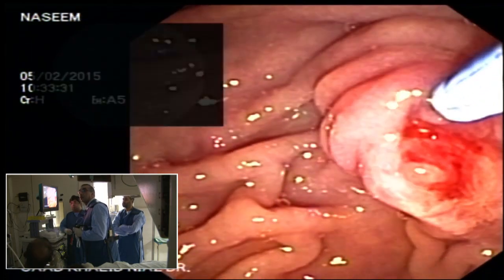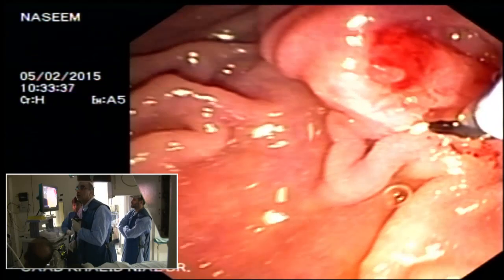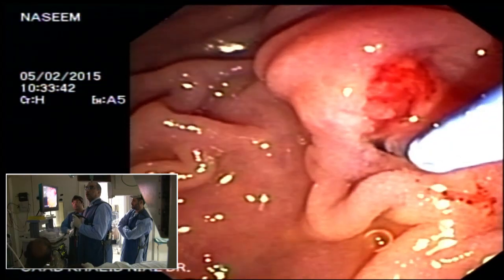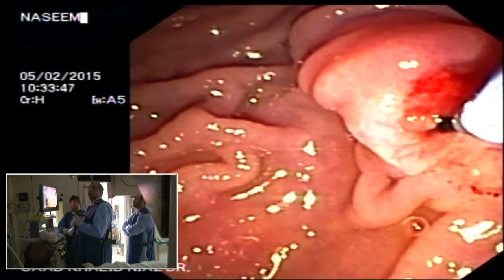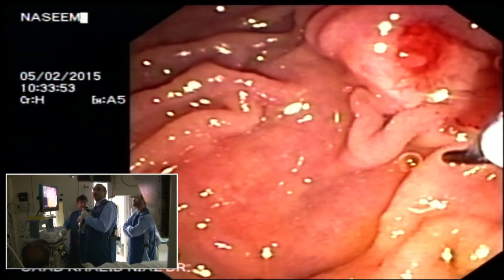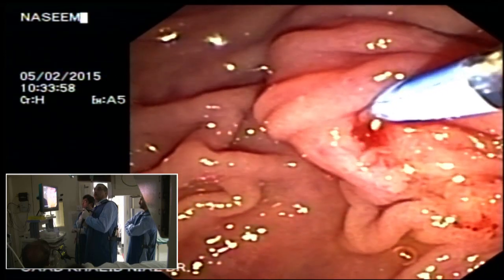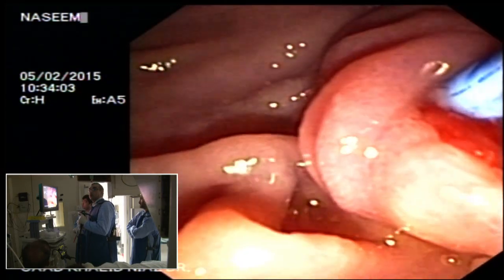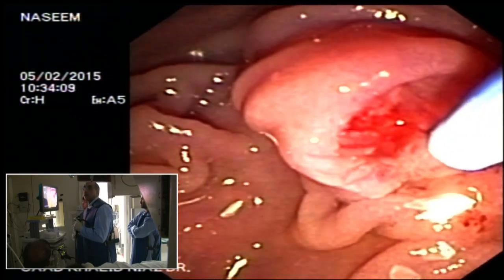You can inject a little bit to get an idea, because I showed a video yesterday, and it's usually a very tight stricture. That's the case. But if nothing is working, in those cases you can do a freehand needle knife without a pancreatic stent. There's another technique called fistulotomy. You just dig into the bile duct from the duodenal wall, but you should never attempt that unless you know exactly what you are doing.